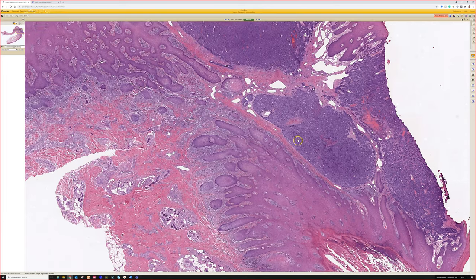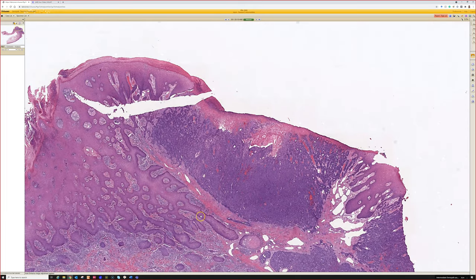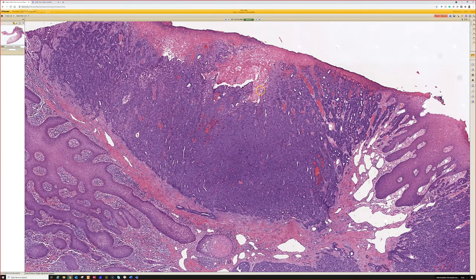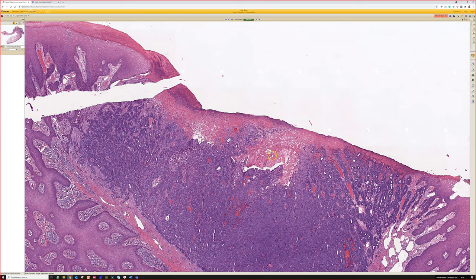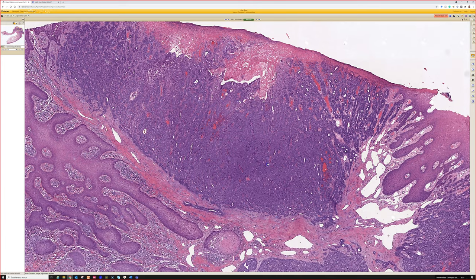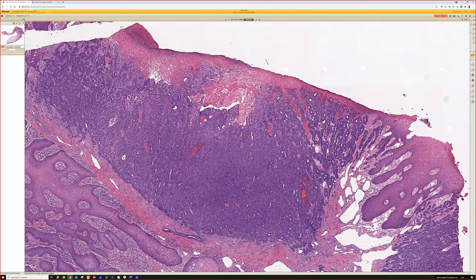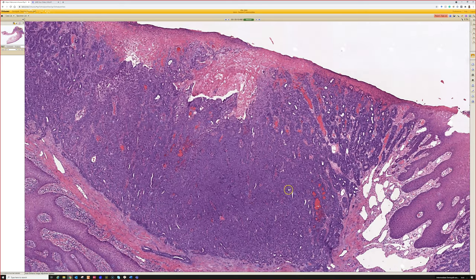Okay. So here's the tumor now. Finally. Sorry about that. I had to do it. We got this blue kind of basaloid looking tumor, very ulcerated. Probably that ulcer was a biopsy site, because usually you're not going to amputate the end of a digit without a biopsy proven diagnosis of something bad, right? So you can cheat on this case and know it's got to be cancer or else someone really messed up, right? So what is it?